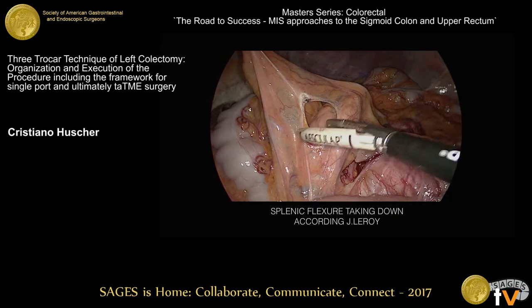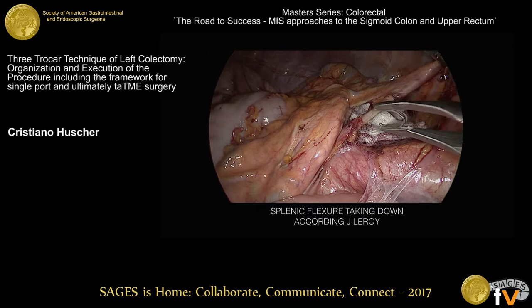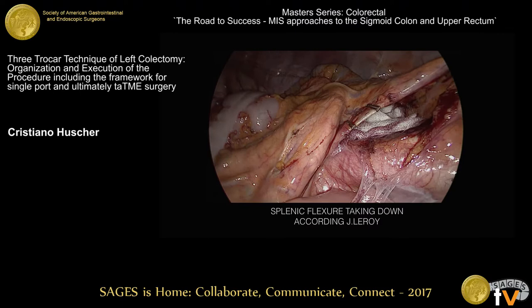After that, we dissect the IMV very close to the confluence at the splenic vein. We clip it and divide it. This is what we do with three, four, five, or six ports — it is the same technique. As you can see in the field, we don't have any instruments dancing around.